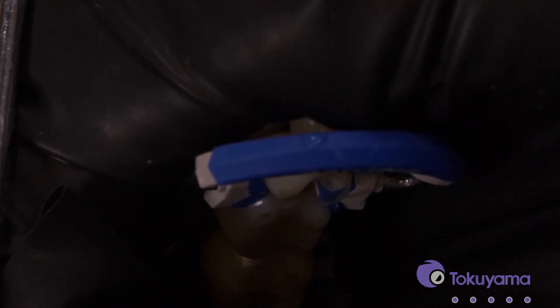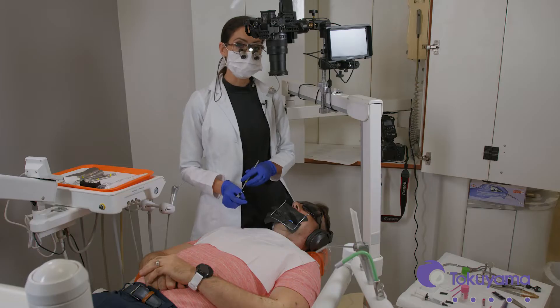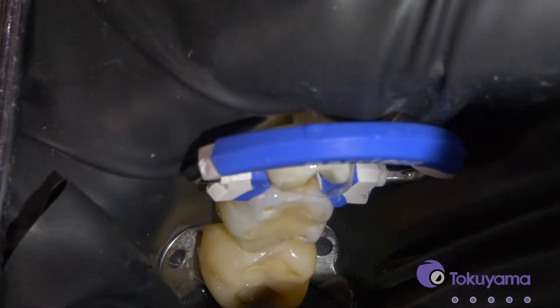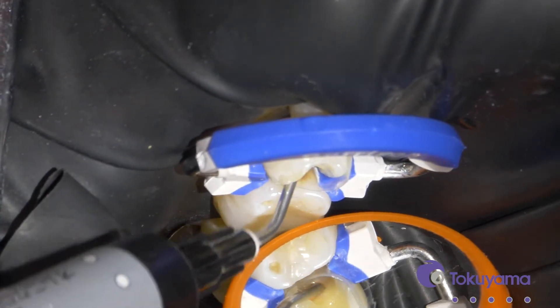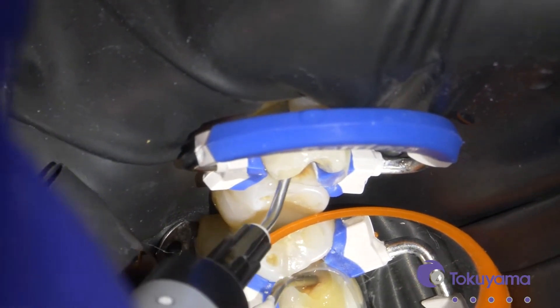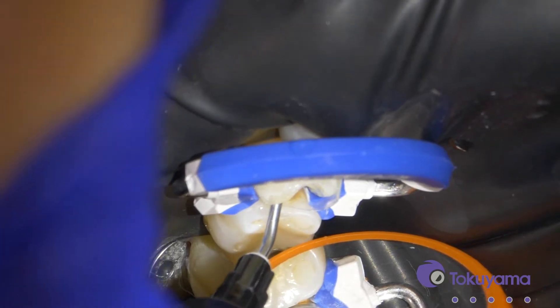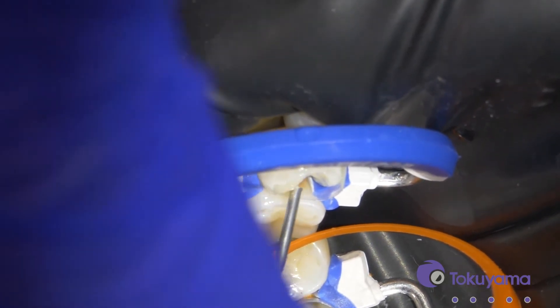The amount of blocker we're going to use to cover the discoloration will depend on the intensity of the discoloration. We're going to start with half a millimeter and then see what that looks like, adding more as needed until we get it covered up. Let's cure that and then I'll add a little more.